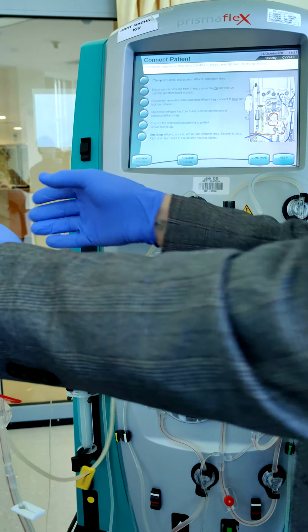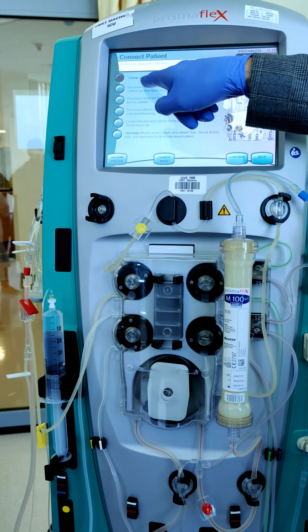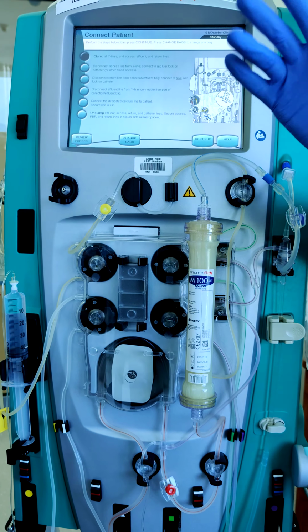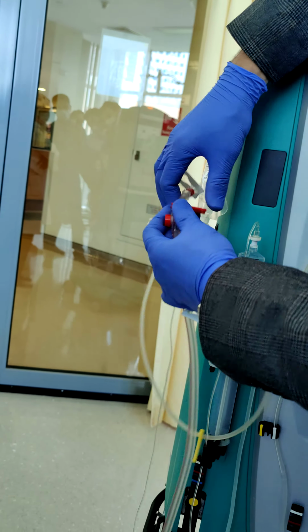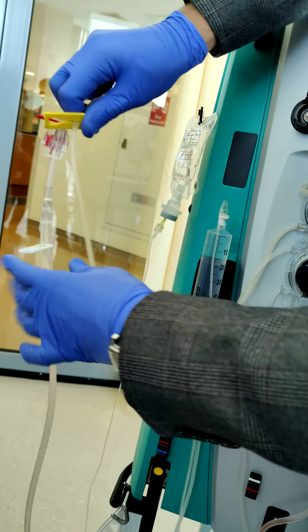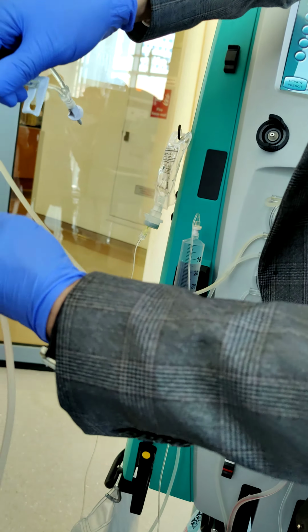Still, this one is hung with the saline bag. Clamp all Y lines and access, effluent and return lines. Actually, it's 6 clamps: 1, 2, 3, 4. Don't clamp the small one. Don't clamp the pre-blood pump one, the white one.